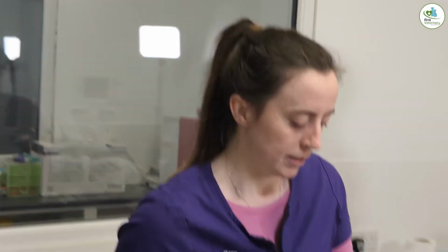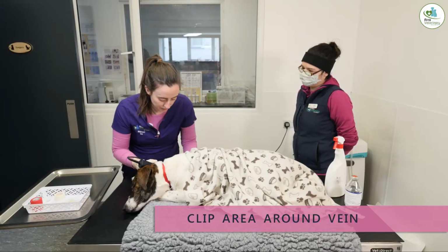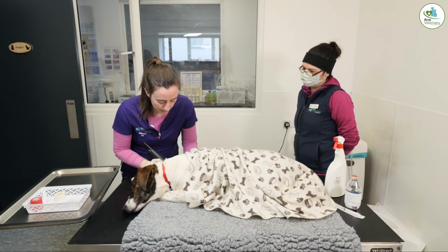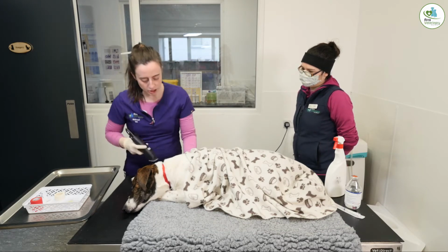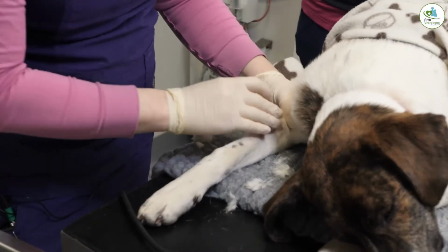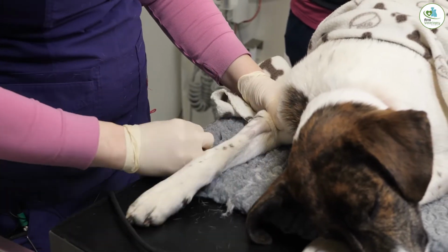So first step then is to clip the area. So this vein is the cephalic vein that we're going to use. So we're going to just clip the hair off it. So I just generally put a little bit of pressure here to raise it so I can feel where it is as I'm clipping, so that I get the right area. So that's it clipped now.